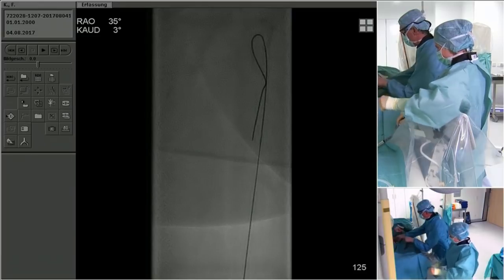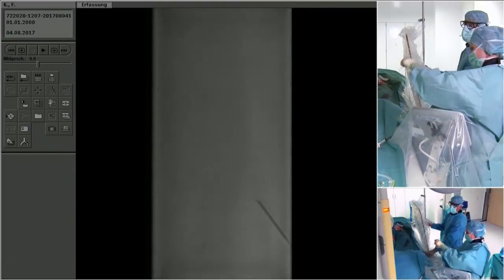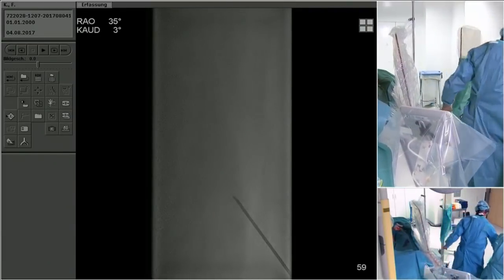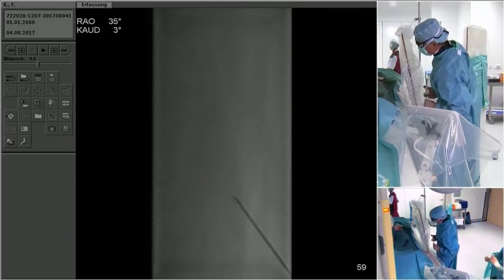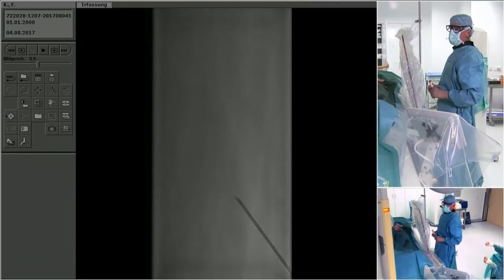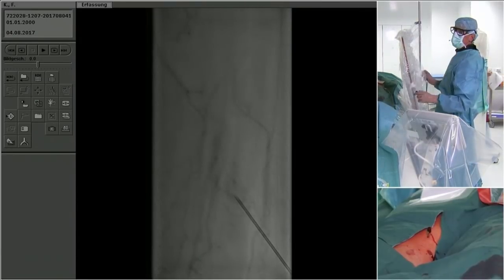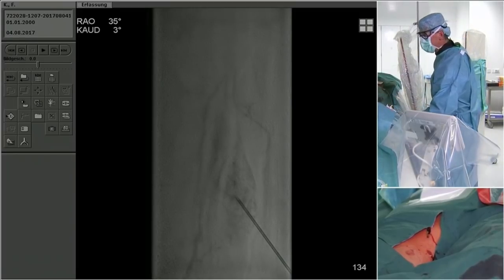Go ahead, Munier, please. So really, I still think ultrasound is much better to go even distally, and you have better purchase here. I mean, you will always get it by ultrasound. No way you cannot get it. Yeah, ultrasound is indeed a good option. Andrej, some comments from the panel here to try to convince you to go a little lower.